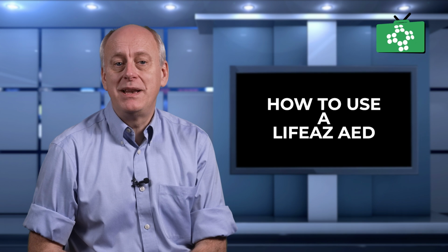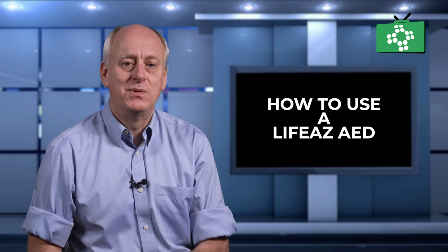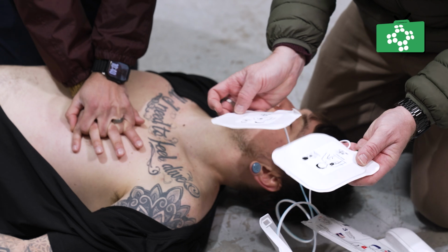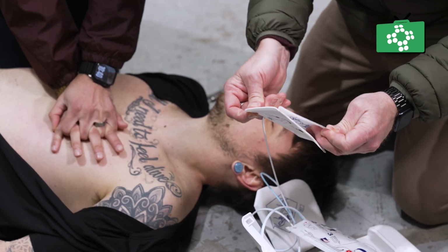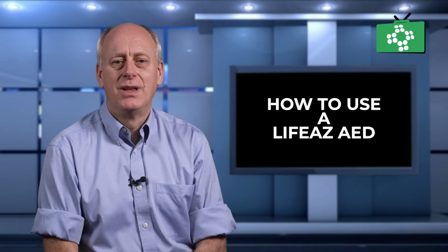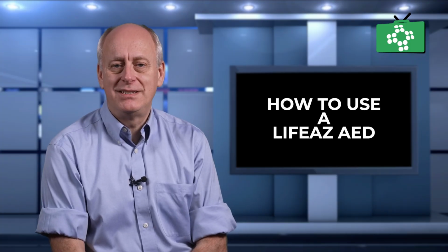Remove any noticeable medical patches, as some contain metal which can interfere with the passage of electric shock from the AED. If you have an AED prep kit, use a razor to remove excess hair, but do not worry if you have nothing to remove it. Remove necklaces away from the chest area to prevent electrical conduction issues.